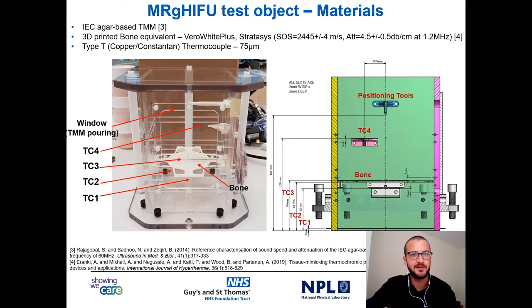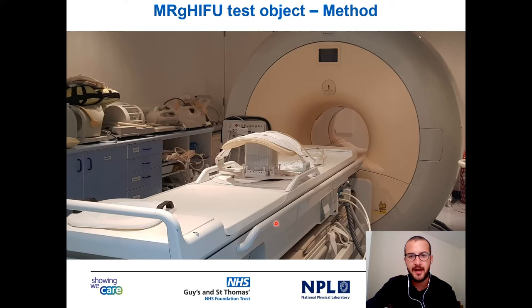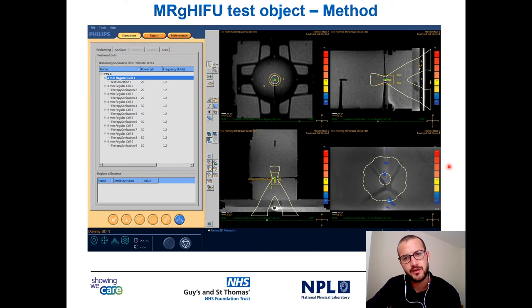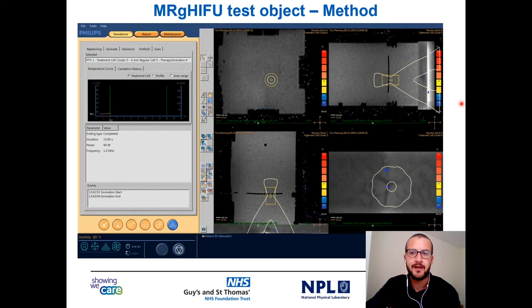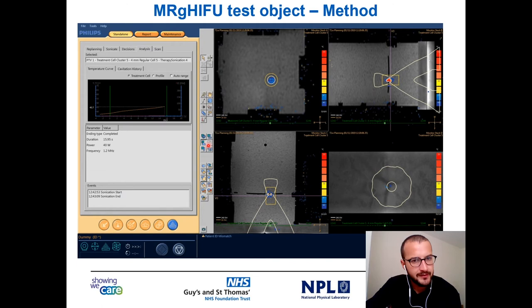Here you can see the setup of the phantom on the Sonalleve. This is the HIFU table, this is the phantom, this is the MRI coil. The HIFU transducer is placed below the phantom. This is a screenshot of the Sonalleve console, so you can see coronal, transverse, and sagittal views of the phantom and monitoring of the near field. You can see the positioning tools and how they help with the identification of the thermocouple, and you can see the 3D-printed bone. What you do is simply place a cell in the region of interest, select the power, press a button, and the sonication will start. MRI thermometry allows temperature monitoring in real time, and the console will tell you information about the power and the length of the exposure.